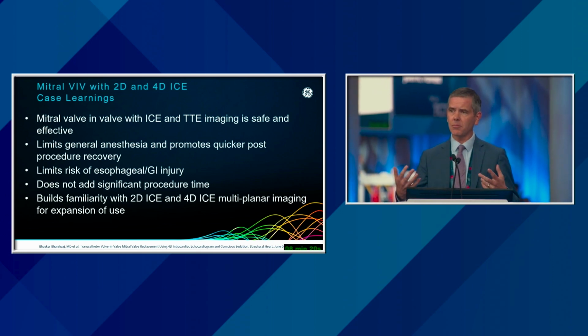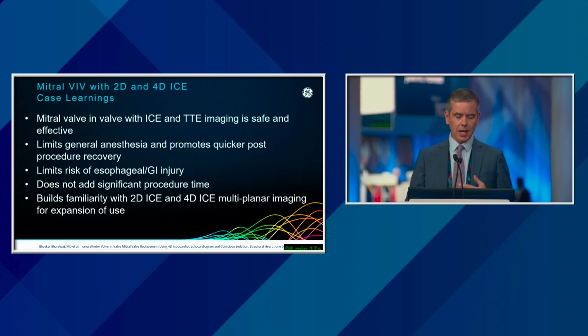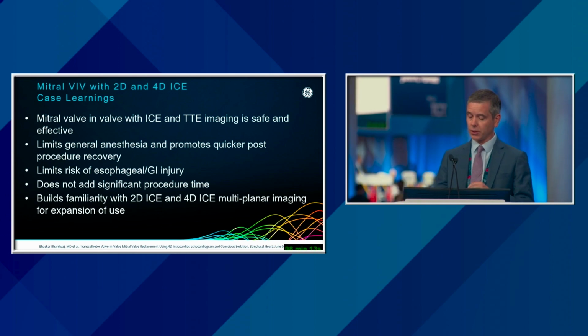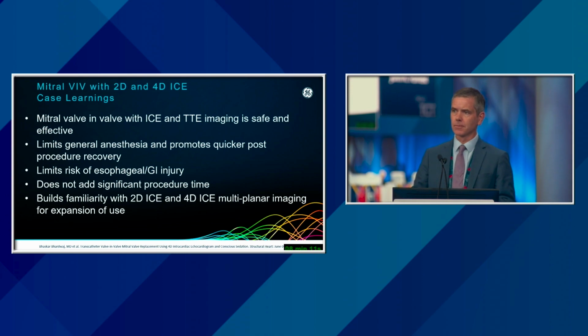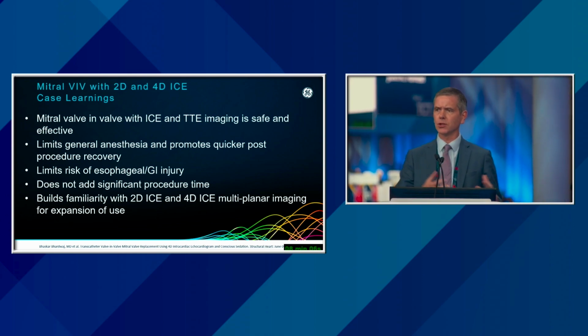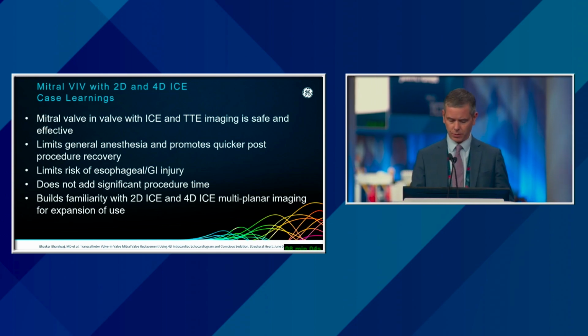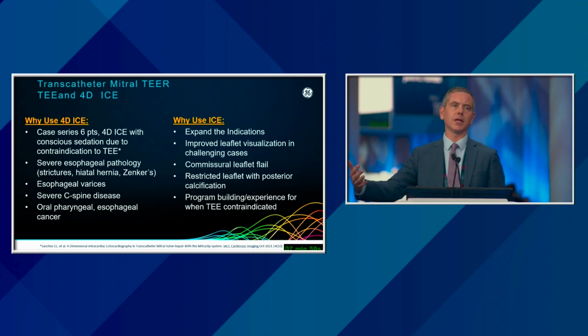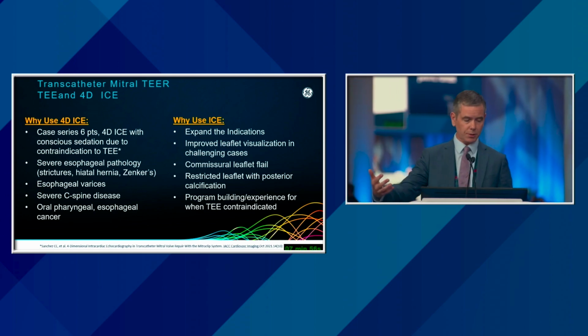And really just beginning with some straightforward cases helps your team build familiarity with both the 2D and the 4D ICE modifications with the flexi slice or multiplanar reconstruction, so you can expand its use into other fields for you. So we utilized those first steps, and we said, okay, our next step is that we want to integrate it into a mitral TEER procedure.